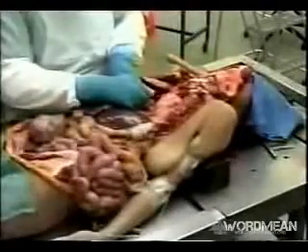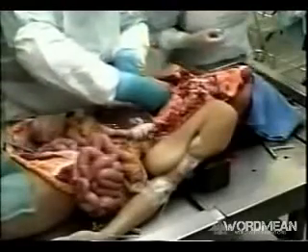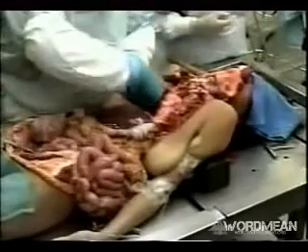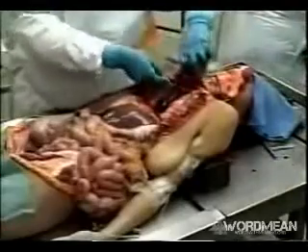What he's doing now is cutting the pulmonary artery and checking to make sure there are no blood clots in there. A pulmonary embolus, which is when somebody throws a clot to the lung, is when a large clot is formed somewhere else in the body and then travels to the lung. What he pulled out was not a clot that formed while the person was alive. That was a post-mortem blood clot.